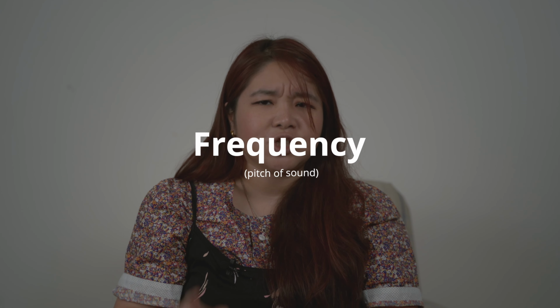So we've covered volume and echo, and now we're going to move on to pitch or frequency. Just a brief bit on this. Pitch is related to how far your sound will travel. For example, the frequency is related to penetration and image quality. The higher the frequency, for example with the linear array probes, the less penetration but the higher the density and quality of your image. And the converse is true, where the lower the frequency, especially with the curvilinear probes, you get deeper penetration but poorer image quality.